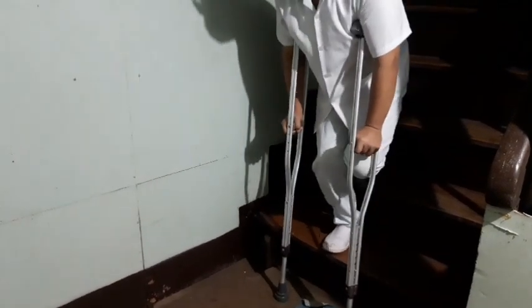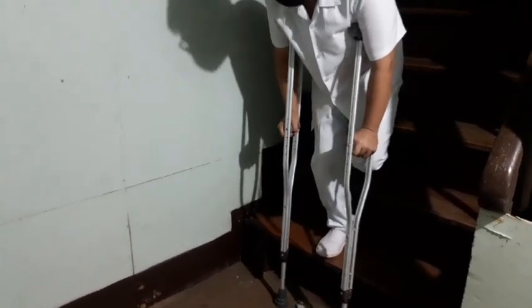For walking down the stairs, stand one step below the person on the affected side. Place both crutches on the same level as the feet. Shift weight to the stronger leg. Lower the affected leg and crutches to the next step while bearing down on the crutch handles. Advance the unaffected leg last. This is how it is done.